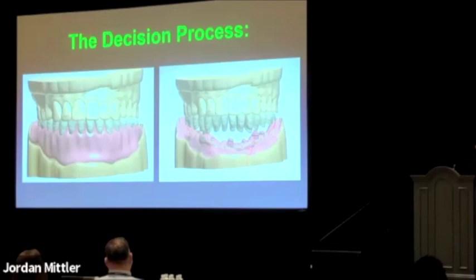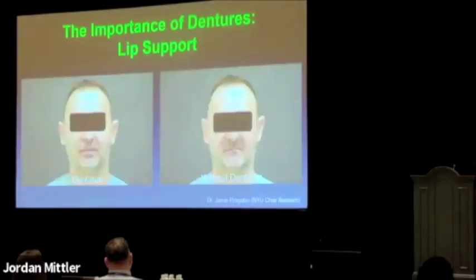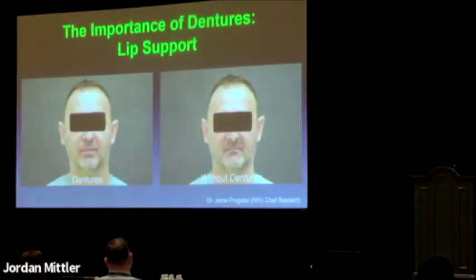The reality is we're losing so much tissue here that you just can't do it. And you really needed an overdenture. And when you look at this measurement, the size of the mandibular teeth, we're talking over 20 millimeters there. That's too much. And sometimes you just have to explain to the patient that we can't do a fixed restoration. This is a treatment done by one of my residents in prosthodontics.